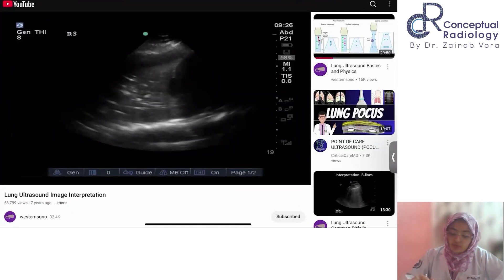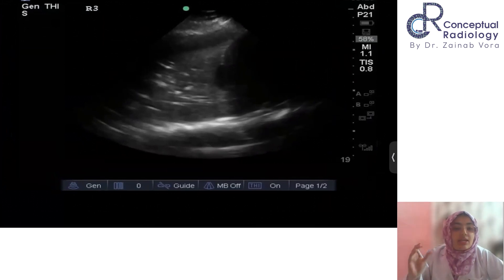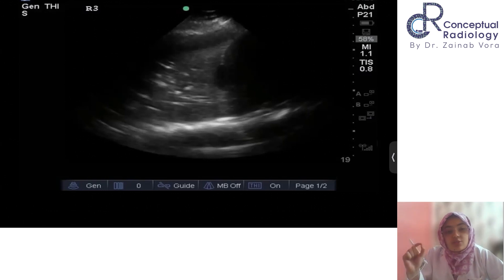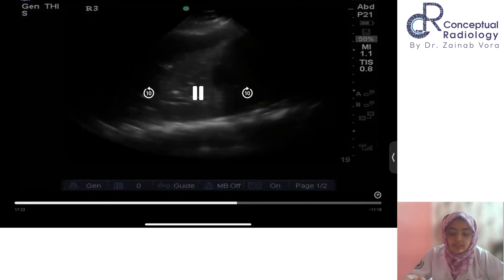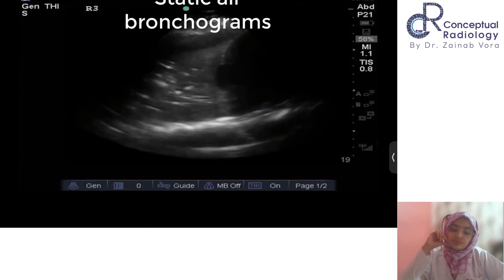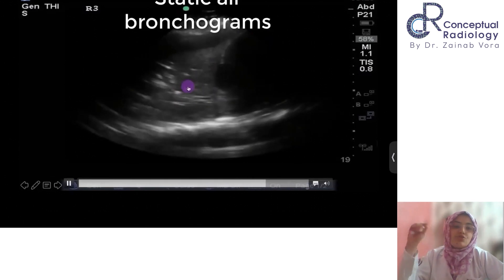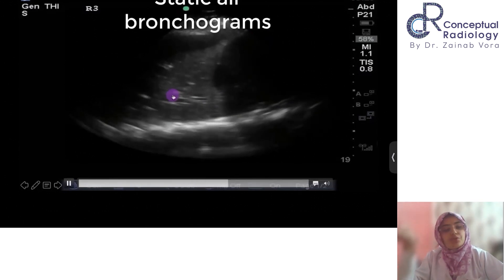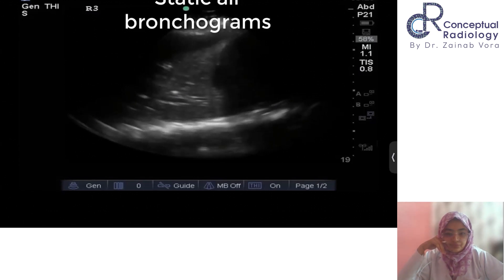So on your screens you can see a collapsed lung giving a hepatized appearance — it actually looks like the liver, but it is the lung. The white echogenic structures inside represent air, because on ultrasound air appears bright. The video starts with the static bronchogram: despite the patient breathing, you will see there is no movement. Static air bronchograms represent air that is trapped within the bronchi — the lung moves, but the air does not show any movement with the patient's breathing. Static air bronchograms can be found with any cause of consolidation but don't really help determine the etiology.